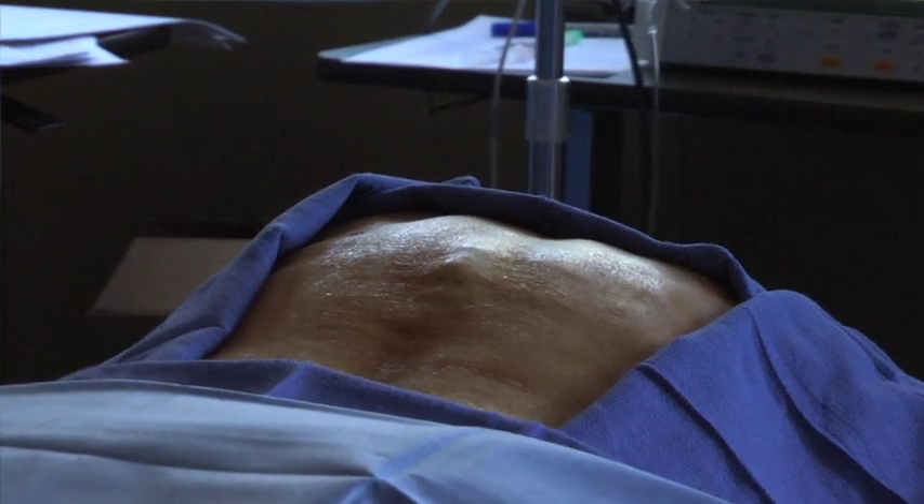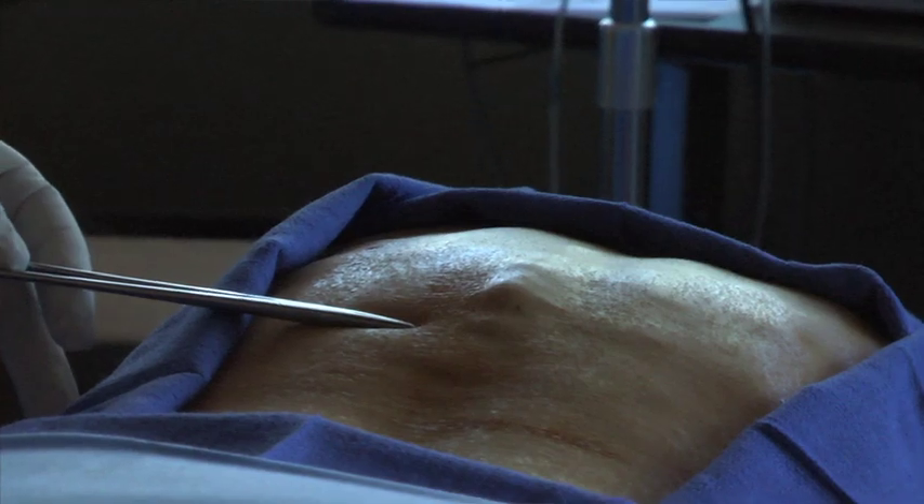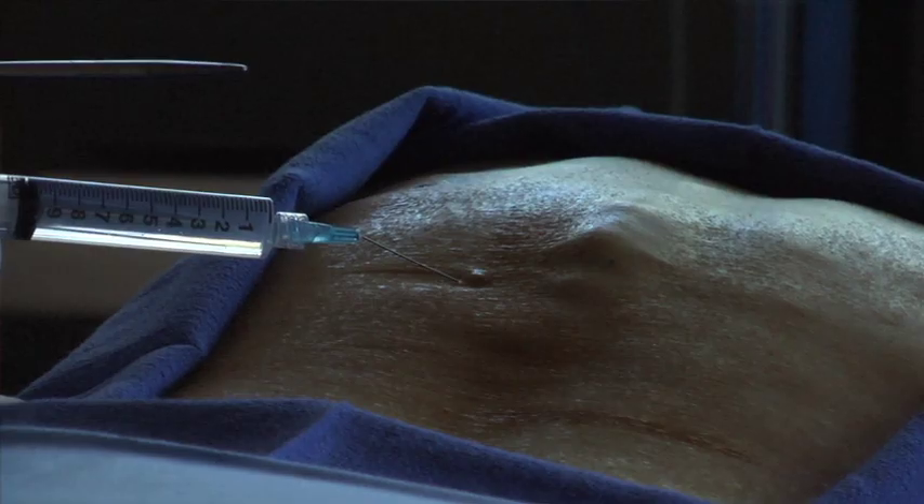The area is prepped and draped in a sterile fashion and a surgical field is created. Numbing medicines such as lidocaine are used to anesthetize the skin.